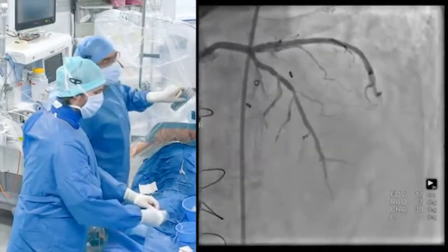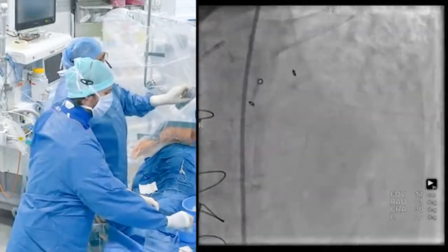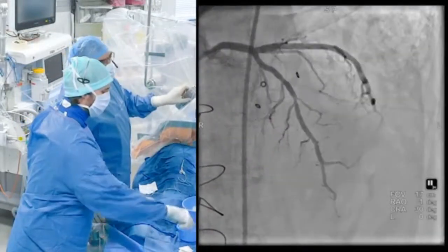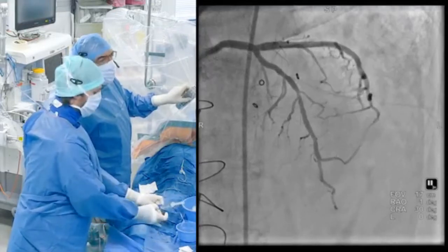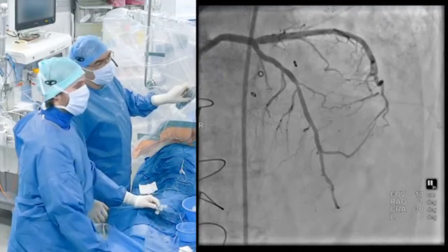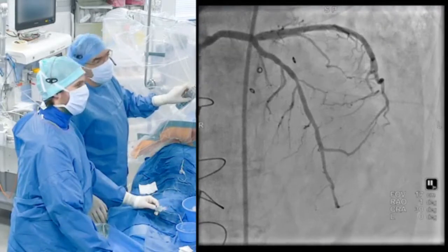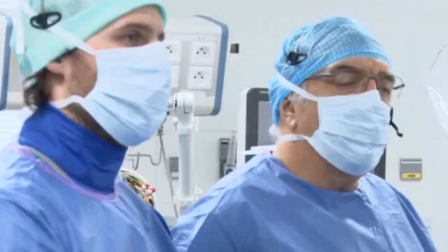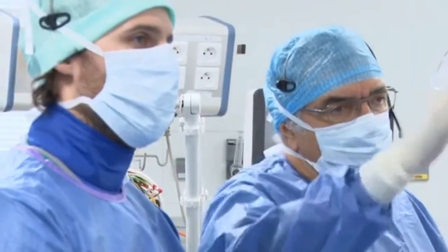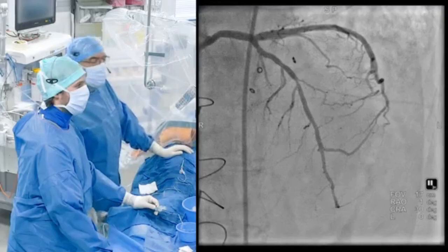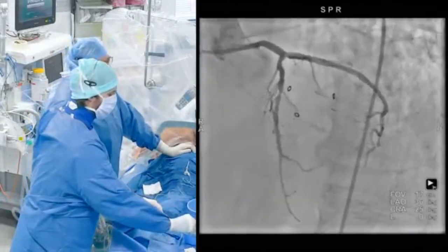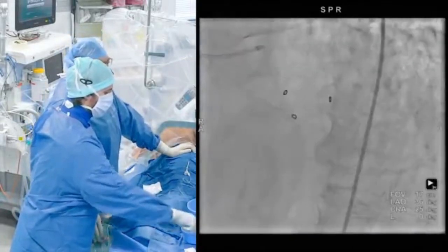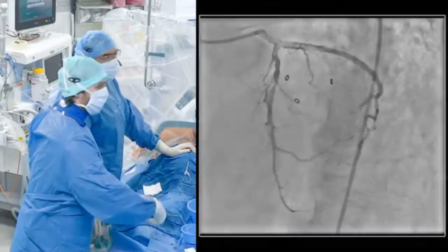This is the view in apicranial, and it's clear that we have a long atheroma plaque on the proximal segment, followed by a quite tight and short lesion at the mid-segment. The distality is correct with a nice diagonal branch. In this view you can see the eccentric lesion on the mid-LAD, with good distality and good flow.